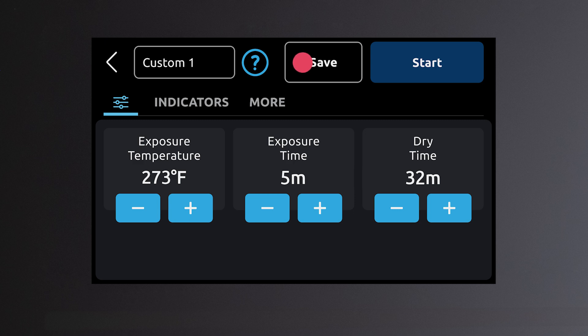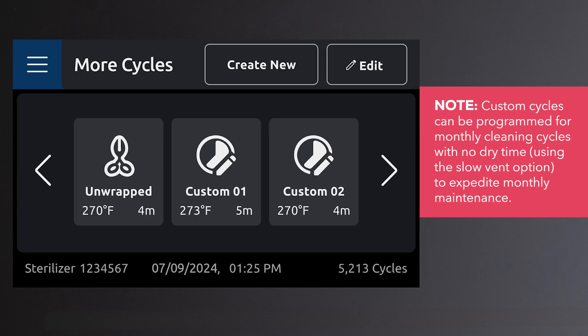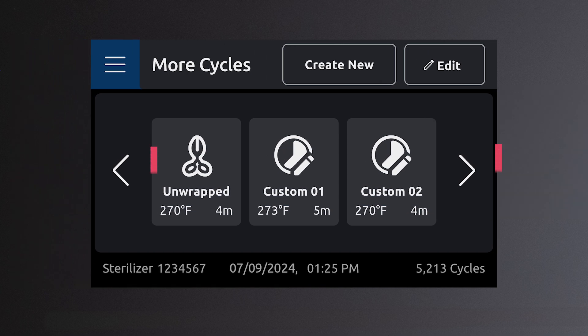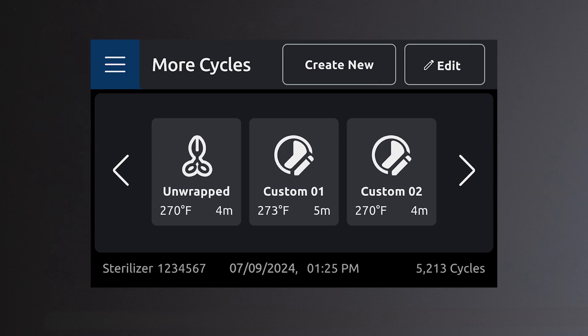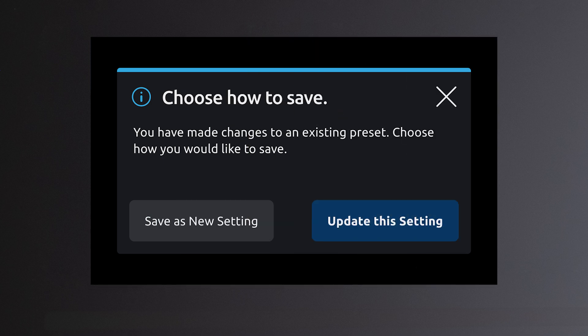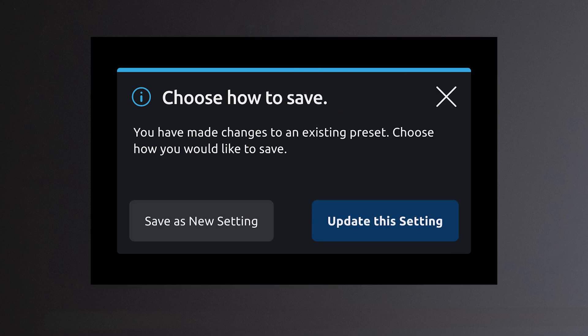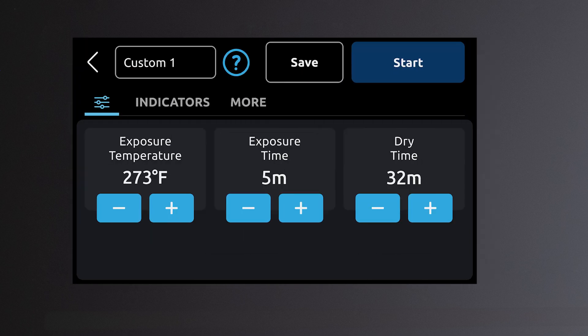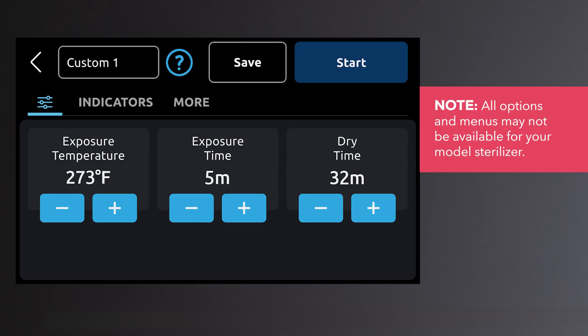Once a custom cycle has been saved, it will appear in the main cycles menu and can be used by scrolling to it and selecting it. Settings within these custom cycles may be changed with options to save as a new preset or update the preset. Once a custom cycle is started, the sterilizer will progress through the same basic stages of sterilization as a standard cycle.